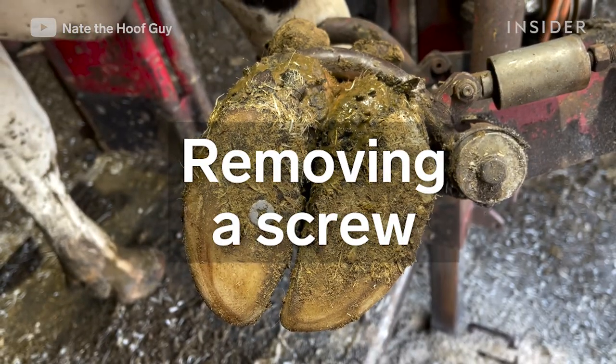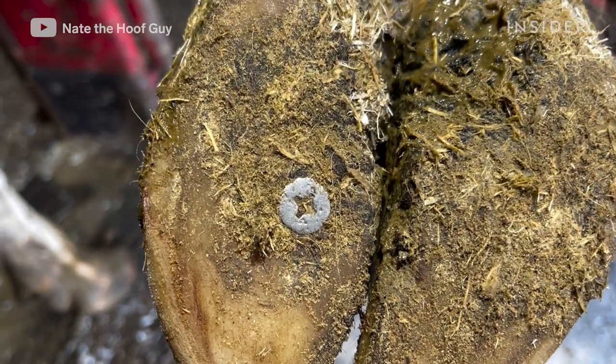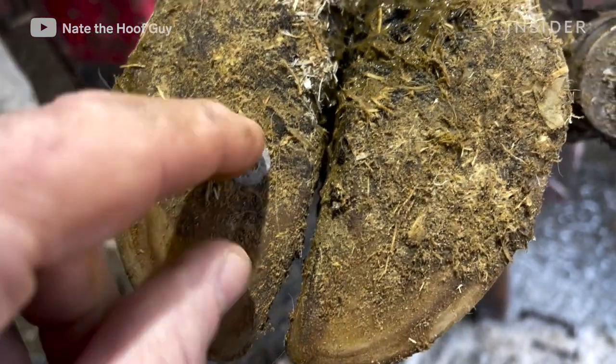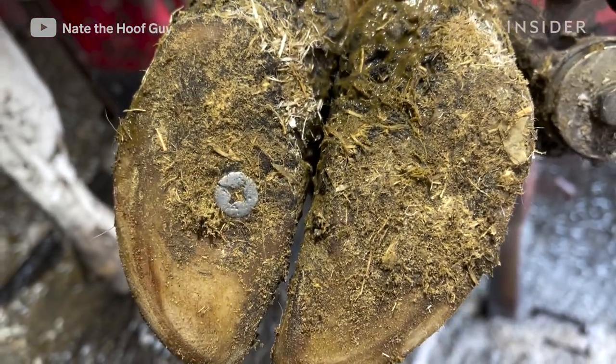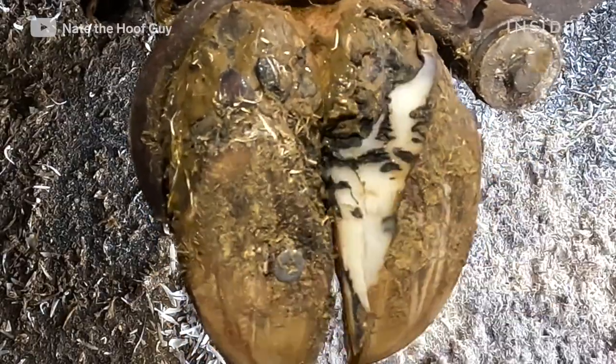What we're looking at here is a cow that has stepped on a screw. At this point I'm not really sure how deep this screw is embedded, so that's what I have to investigate. Is there pain here? Is this a long screw that's all the way through that hoof capsule and into the corium, or is it just a surface problem?